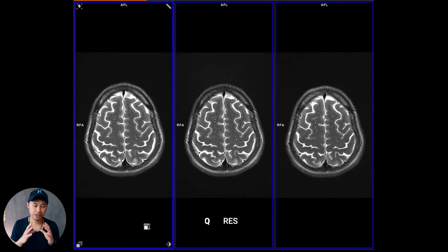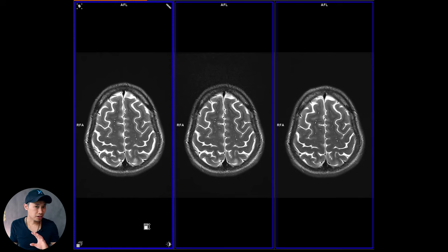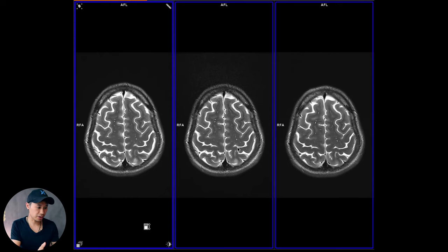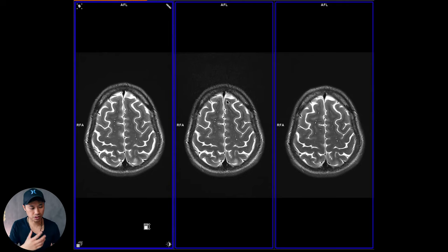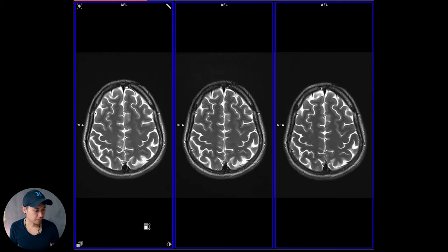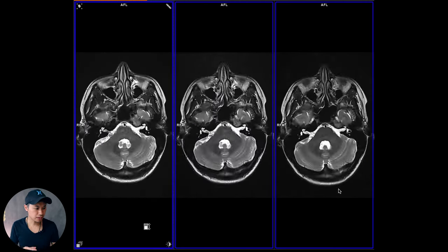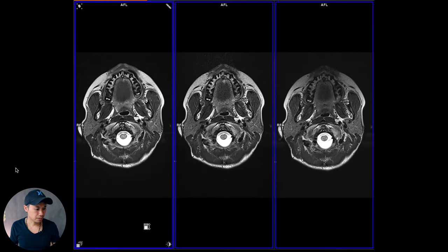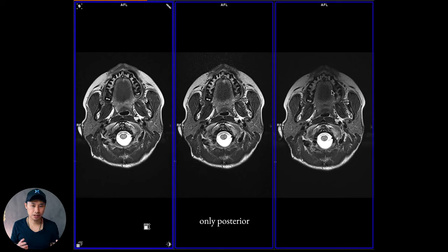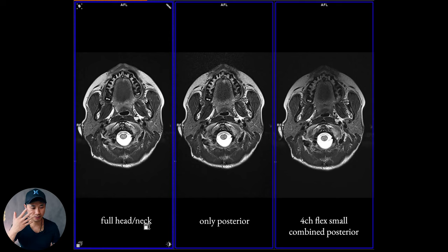Let's check the results. There are three different images right here. The middle one you can already spot — there's noise in the front, meaning the anterior coil part is missing. But look at the first and third ones — it's difficult to spot the differences. You can see the signal intensity here drops off, which means that one is with the small flex coil in front and the other is the full head-neck 20.